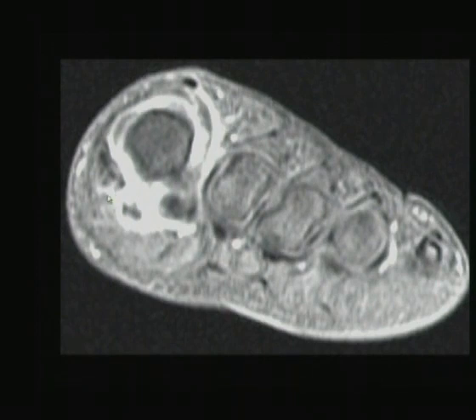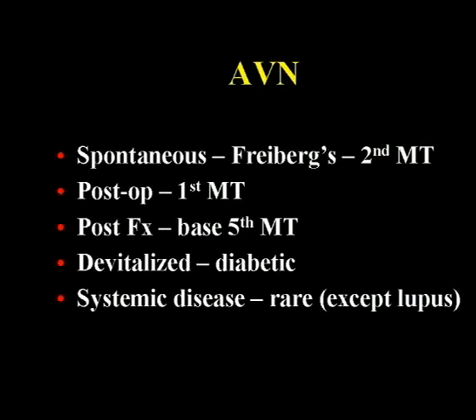Here is a patient with synovitis of the second and third metatarsal phalangeal joints on a contrast-enhanced image. Even without contrast, this volume of fluid is abnormal. The next topic is avascular necrosis, which you see all the time on plain films in the second metatarsal — Freiberg's infarction, which we'll call spontaneous for this lecture.